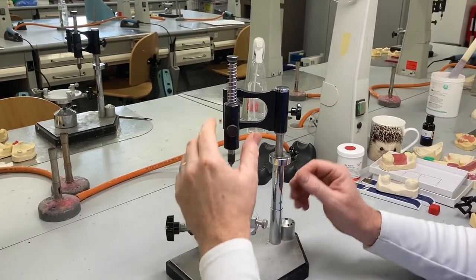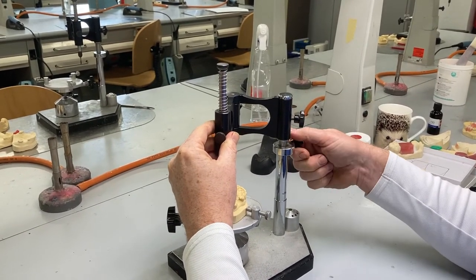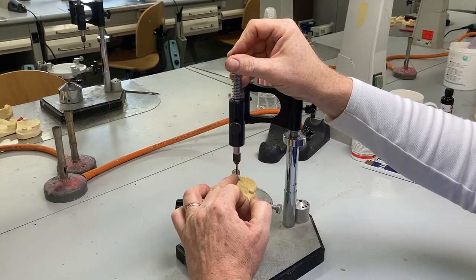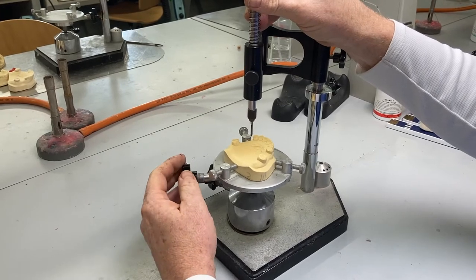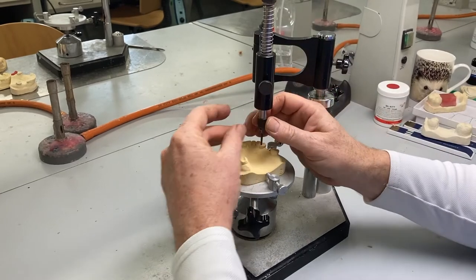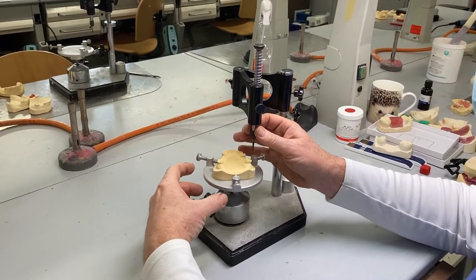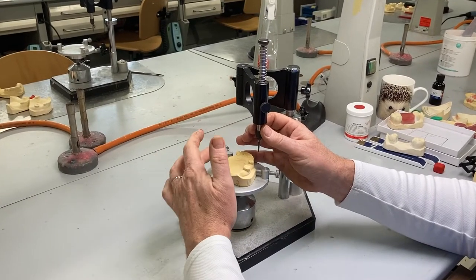Now we need to adjust the surveyor arm so the pencil lead can come down to the gingival level. We use the side of the pencil lead for marking the side of the tooth. This comes into play at the third step through the design process — we've already thought about where the saddles are going to be and where the support is going to come from for this partial denture. Now we're thinking about retention, so we want to survey the relevant teeth to the design.